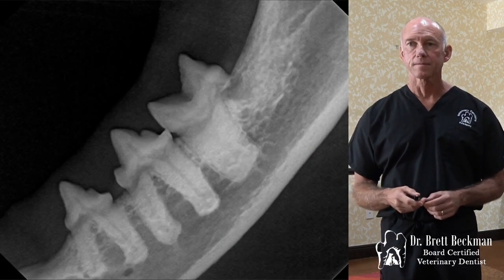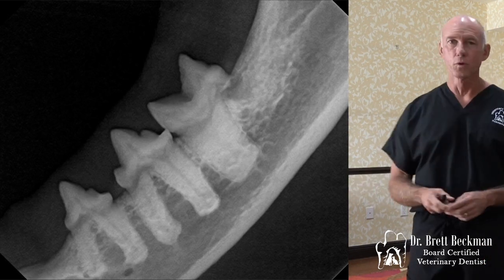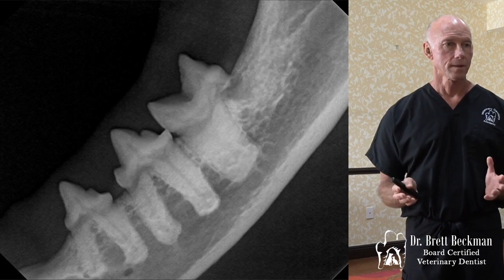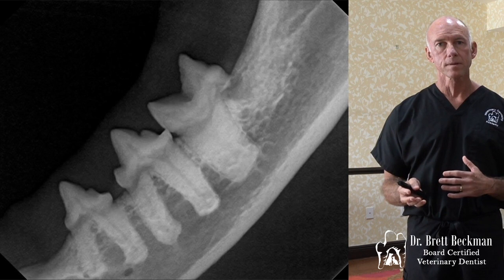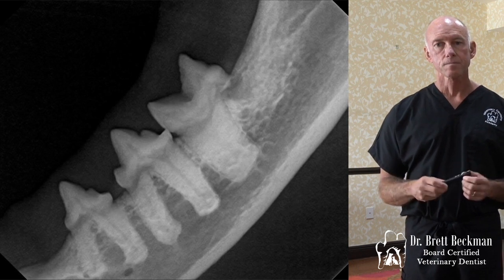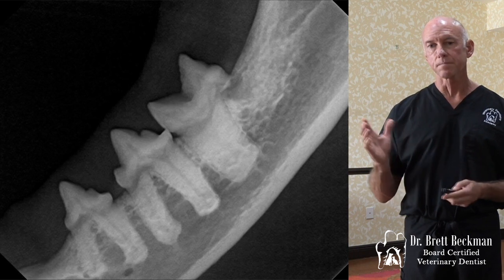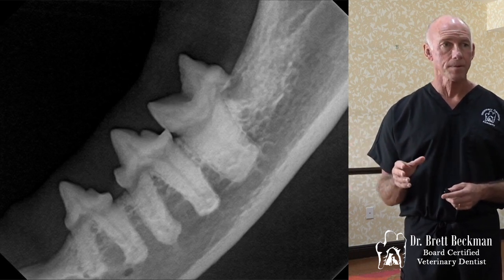Look at it radiographically. There is no root there. It's been totally resorbed, and now you've got that lucency at the marginal bone level, so you've got really nothing to do except clean that distal area up.